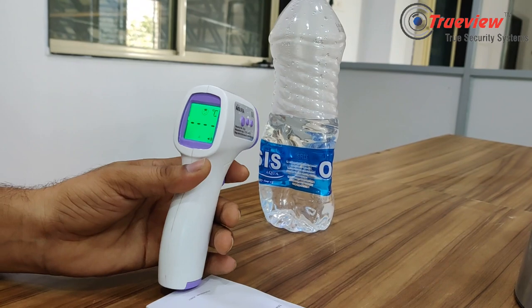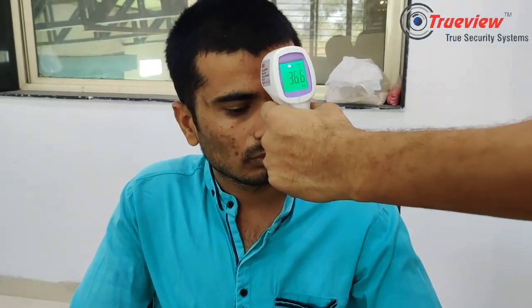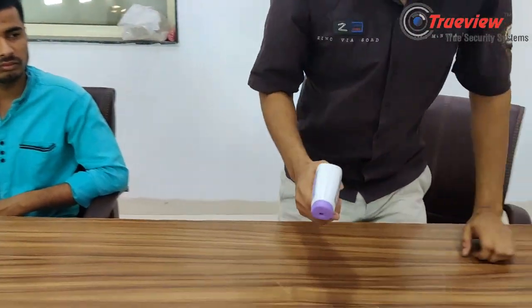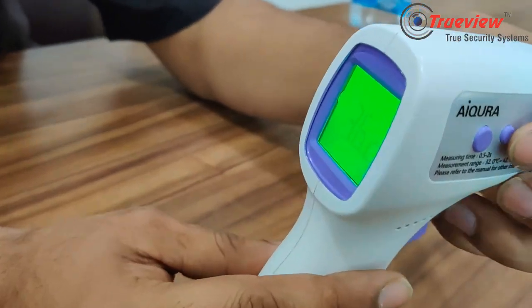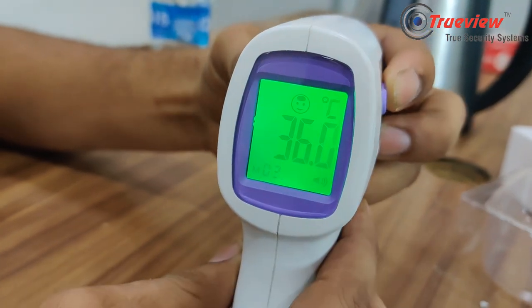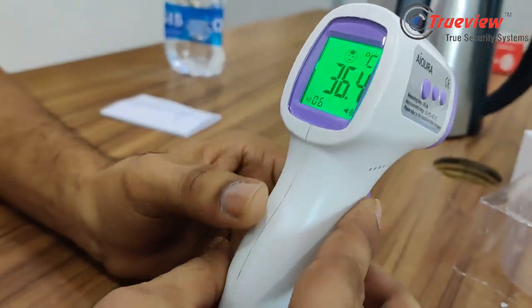As you can see here, the reading is 40.4°C, and the red display means this is a high temperature alert for that person. Other readings are 36.6°C and 36.2°C. If you press the memory button to check back the stored records — M1 shows 36.2, then 36.6, 40.4, and 38.9°C — you can check back up to 16 records.